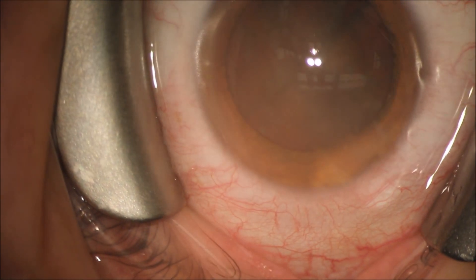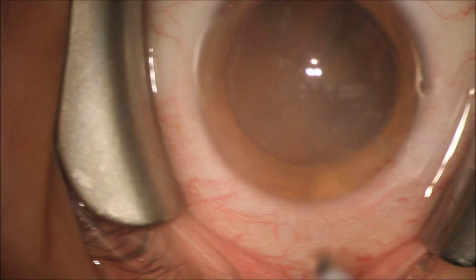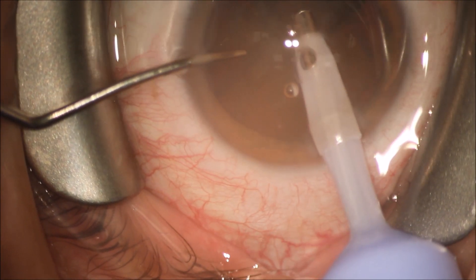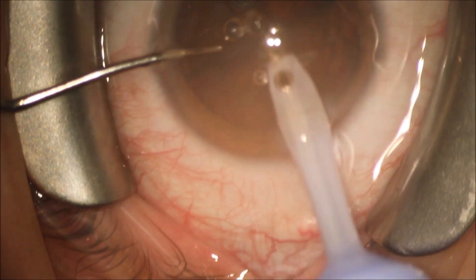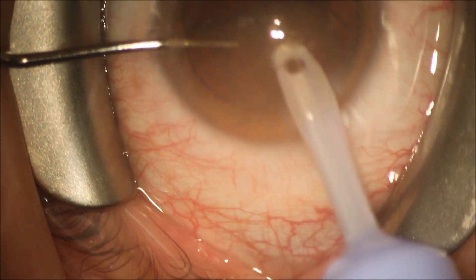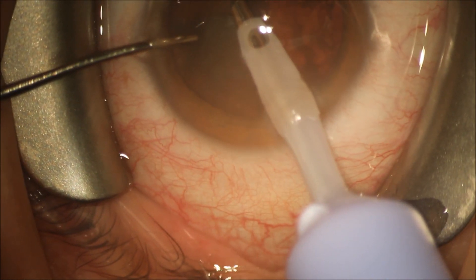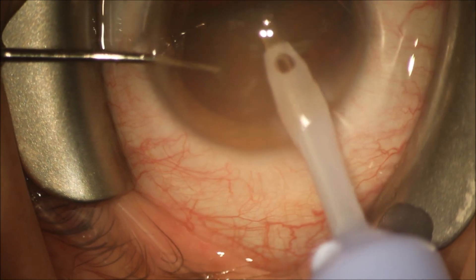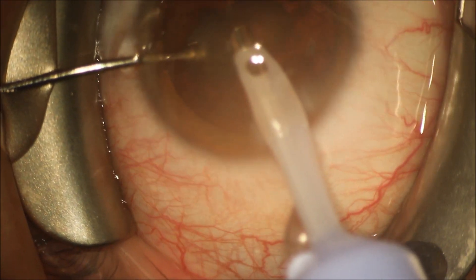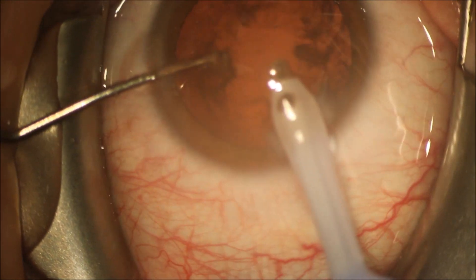The nucleus is probably of a moderate density of approximately 2 to 3 plus, as we grade it out of 4. We're going to suck out each of the individual pieces of the cataract with a phacoemulsifier handpiece. There's a little needle at the end of the handpiece that has aspiration — it sucks in the cataract, and the needle vibrates at 20 to 40,000 times a second, breaking up the cataract into a semi-liquid state that's sucked out through that small incision. BSS, or balanced salt solution, is also placed in the eye around the blue sleeve around the needle, keeping the eye formed as the cataract pieces are removed.